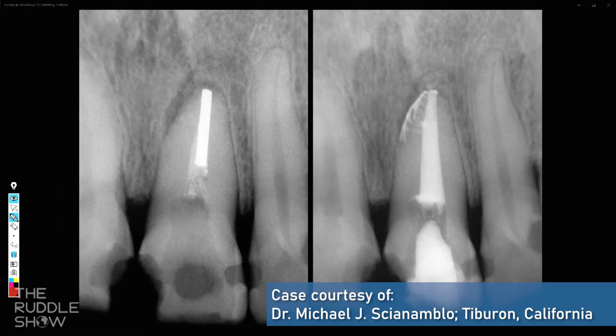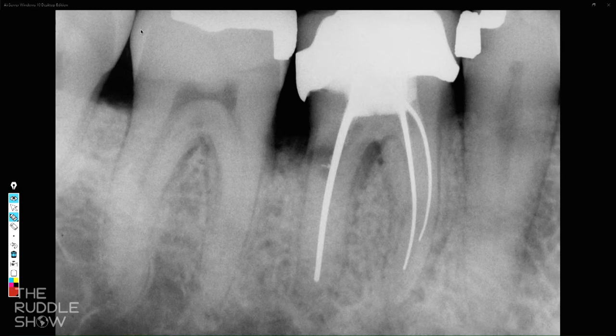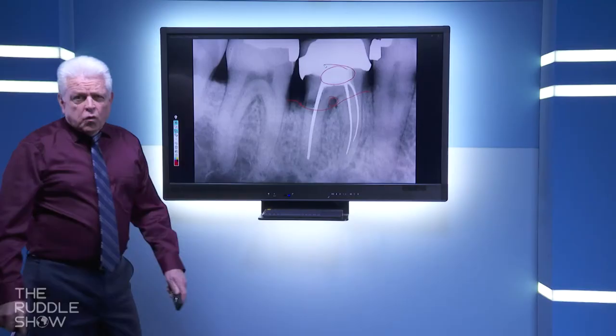In the last case, one of my referrals, he came in with a little problem, he said. He waited so long that he's lost the crest of bone. He has a little infrabony pocket. You can see it's probably scalloping around like this. Got a little furcal problem. It's an old silver point case. Very thin ones, medium-sized one, quite thick one, and all entombed in a buildup. Measure twice. You can only cut once.